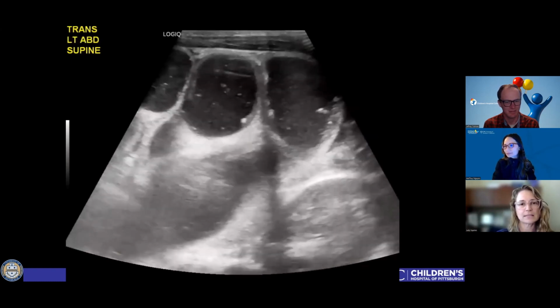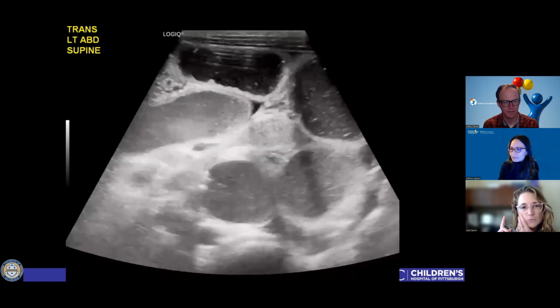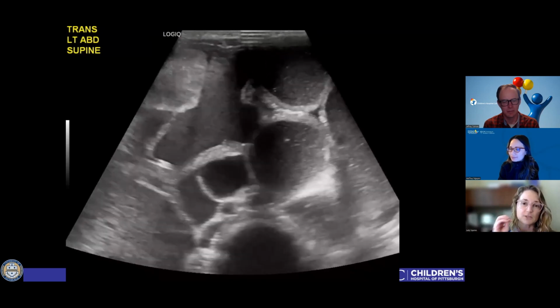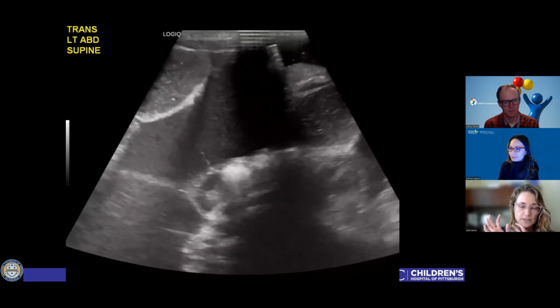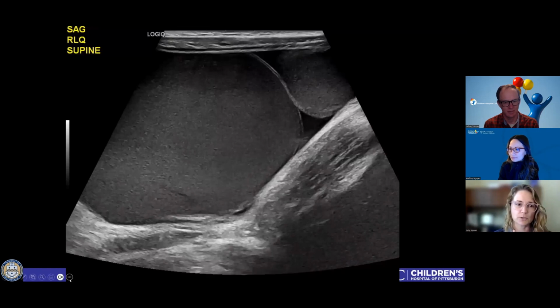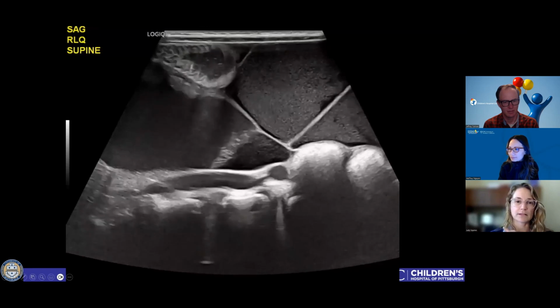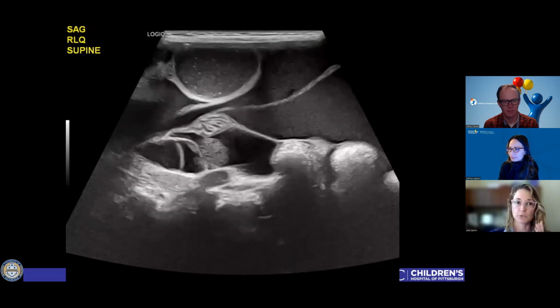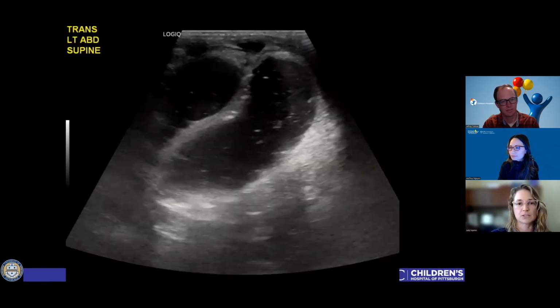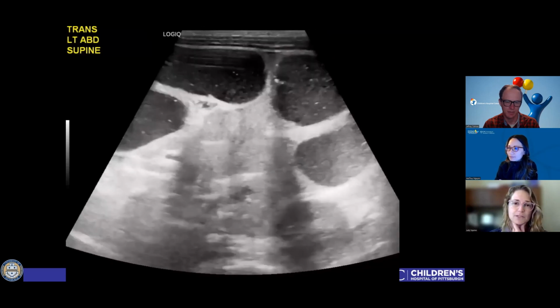One more cine, this is of the left side of the abdomen. And one point I also wanted to make about this is this cine, if you compare the image quality of the bowel wall, the intraluminal content of this compared to this prior cine, the detail is just so much better. So these first two cines were taken with like a superficial small parts preset where you have nice high frequency. The settings are just much more optimized to showing you this detail as opposed to this, which was, I think, an abdomen preset.